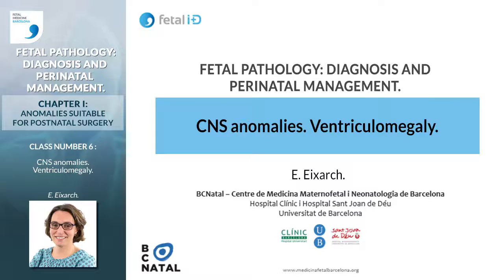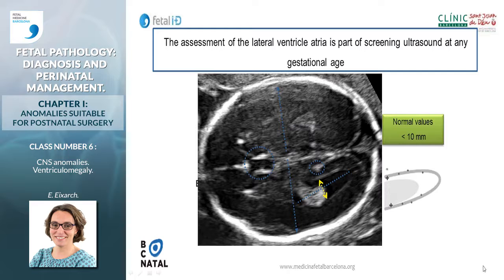We are going to talk about the diagnosis, the differential diagnosis, and the management of ventriculomegaly. And we will start by defining what is ventriculomegaly. We have to remember that the lateral ventricle atrium must be evaluated in the screening scan at any gestational age.